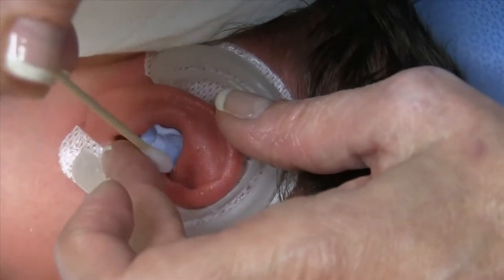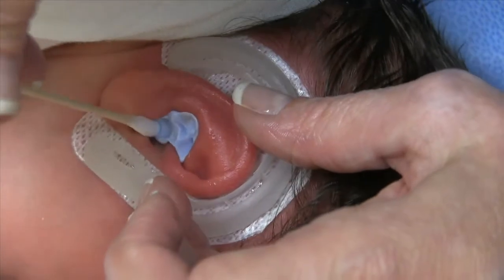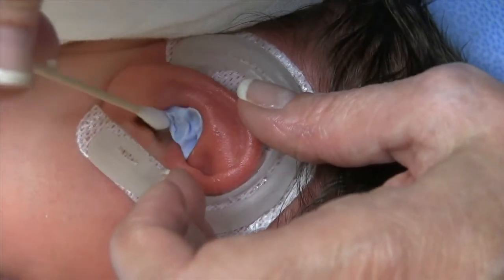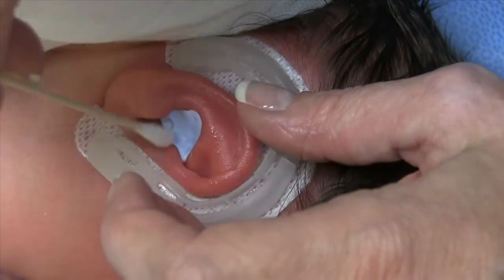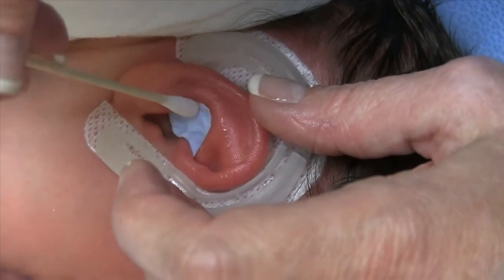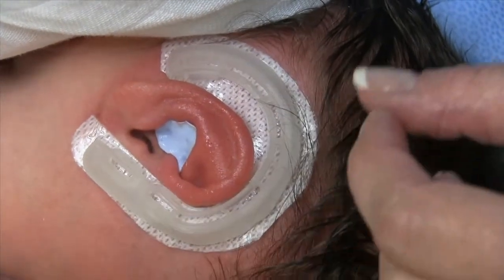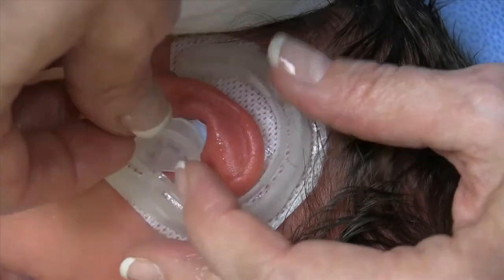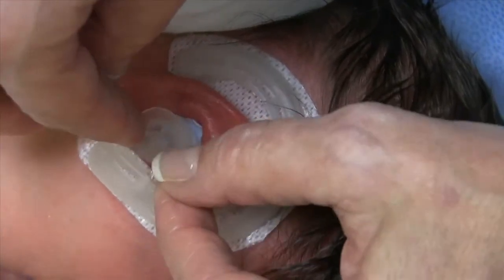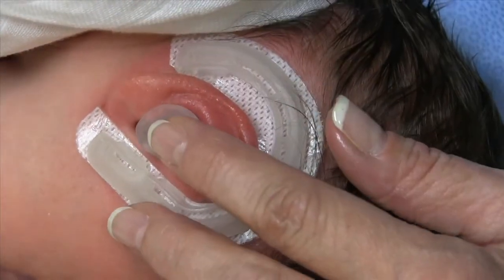We're going to put this here as a base, get it all the way back on the lateral wall. We're not going down into the ear canal, we're keeping it out of there, but we're keeping it in the conchal bowl. See how that nicely molds in there? And then we're going to fit the conformer — or the former — on top of that, so we can create that downward pressure to help eradicate that conchal crus.